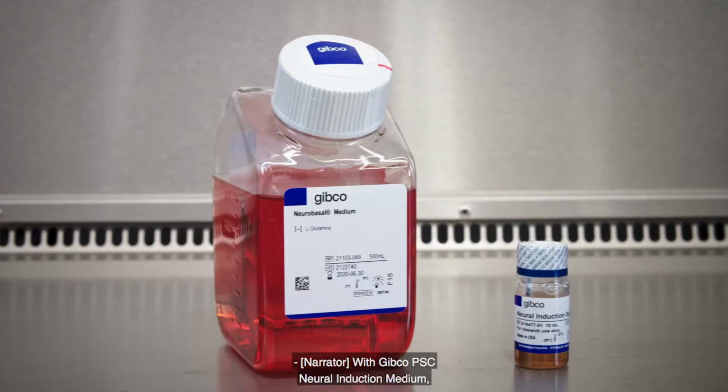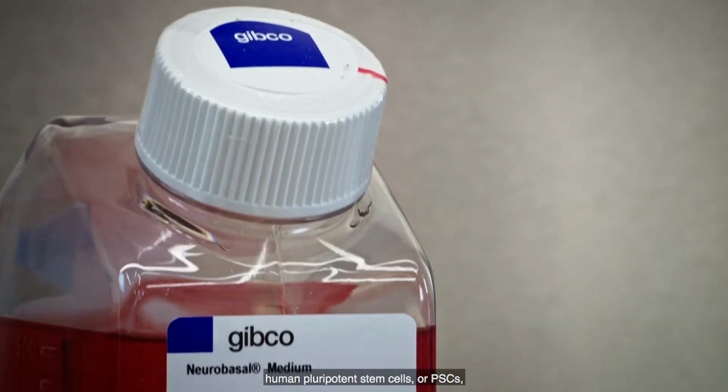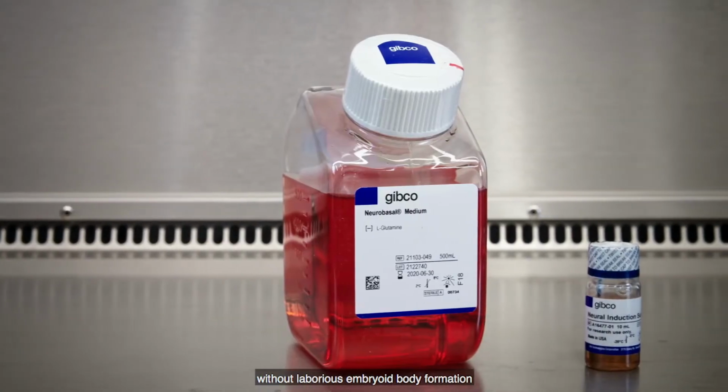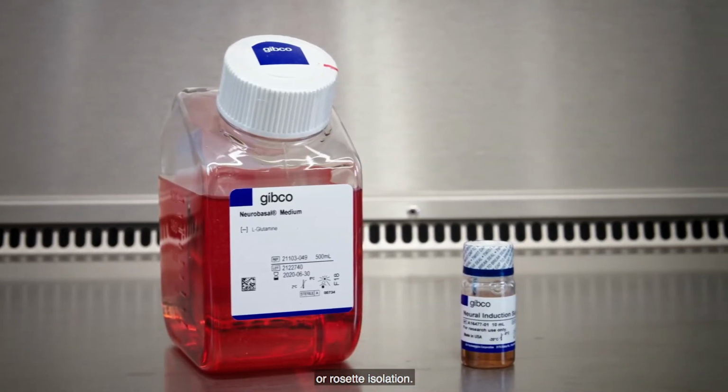With Gibco PSC neural induction medium, you can efficiently convert 1 million human pluripotent stem cells, or PSCs, into 20 million neural stem cells without laborious embryoid body formation or rosette isolation.